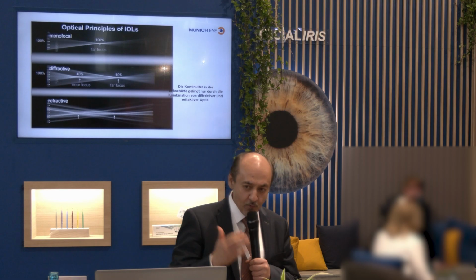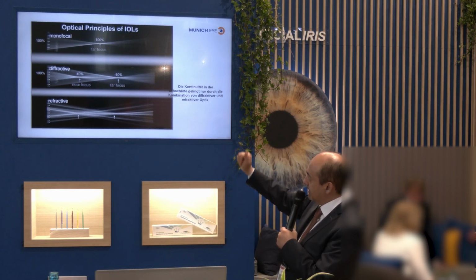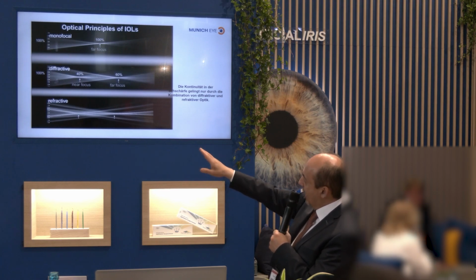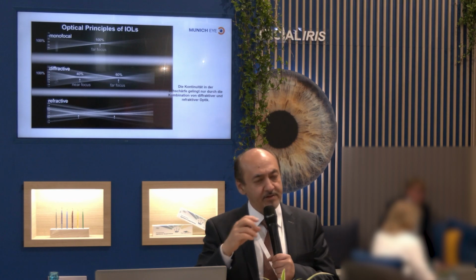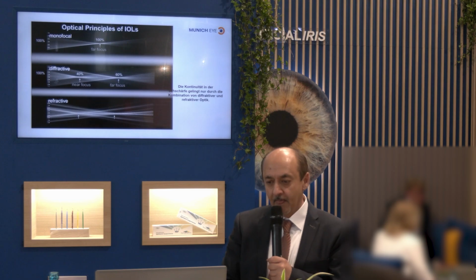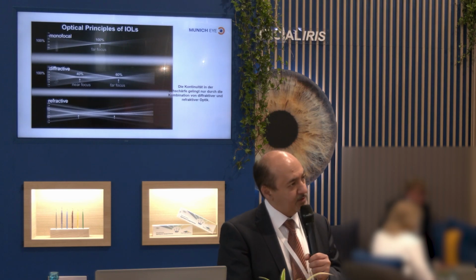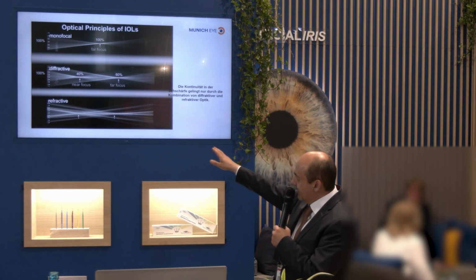A monofocal lens has a focus in the center, while a diffractive multifocal lens has 2 different foci and some overlap, which patients often describe as light scattering or halos with diffractive lenses. Refractive lenses, another principle for creating multifocality, result in a slightly blurrier image, but still allow for 2 distinct focal points.